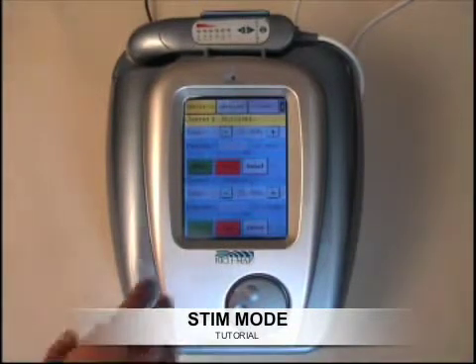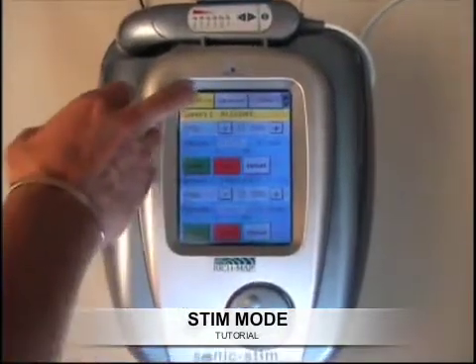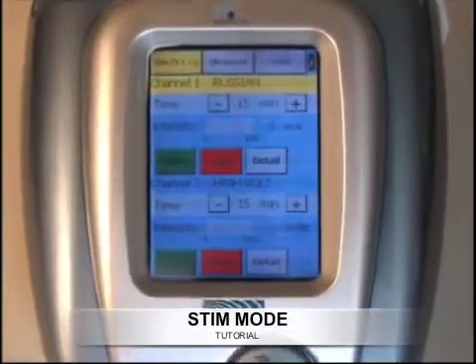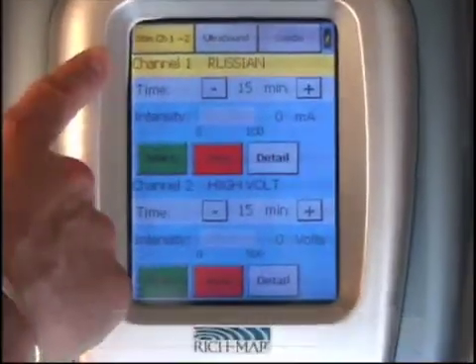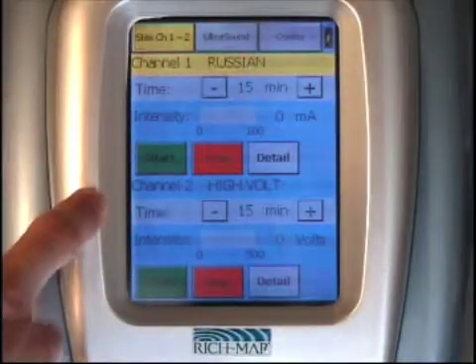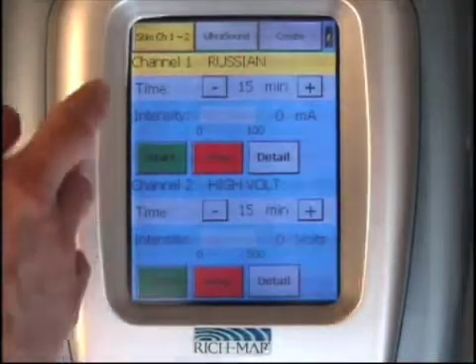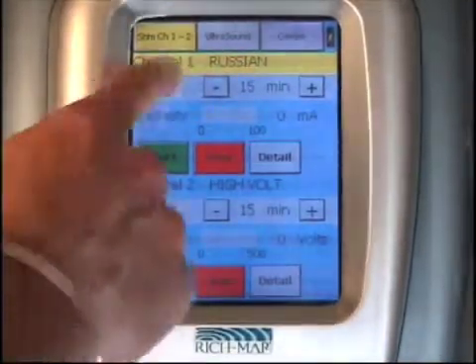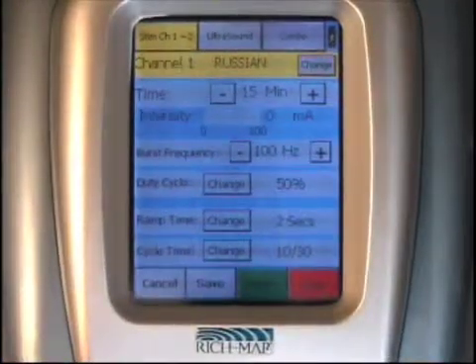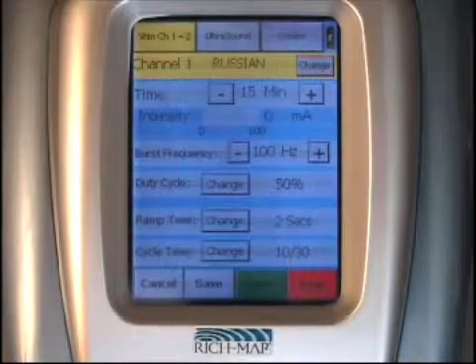The Sonic Stem feature of the unit is indicated by the illuminated tab at the top of the unit. Once you select the tab, the yellow light illuminates and you control the unit through channel one and channel two. The screen is divided into two separate segments, and by selecting channel one, which is already selected, you access it.